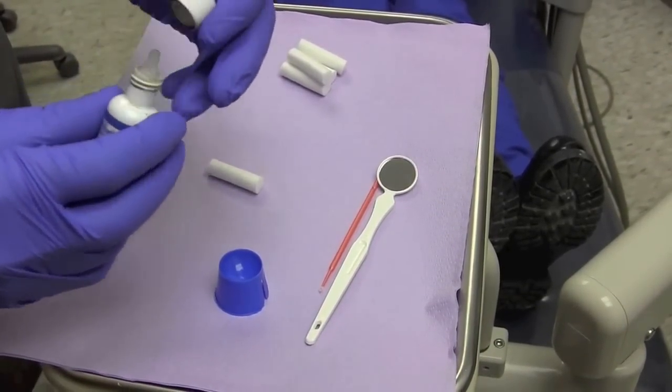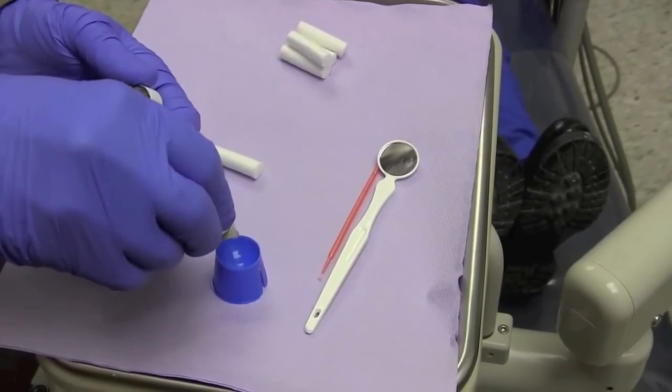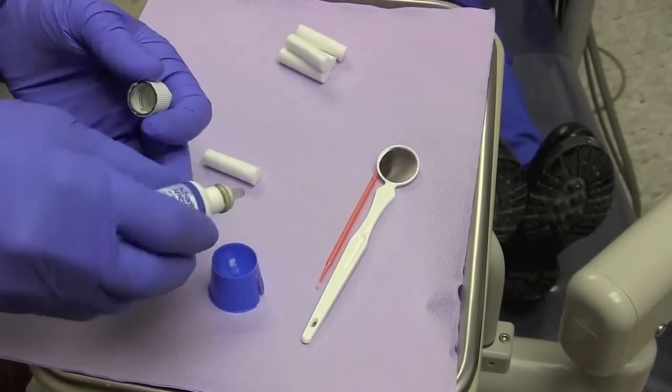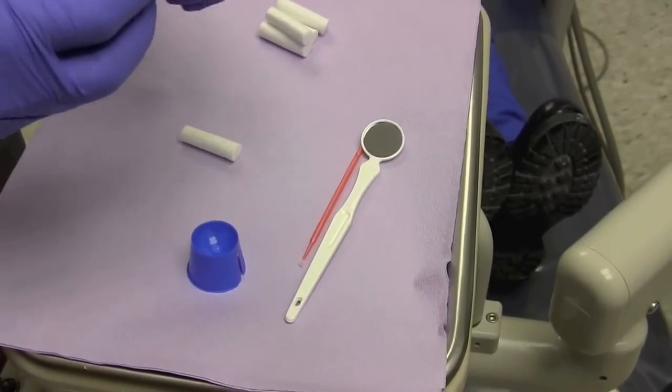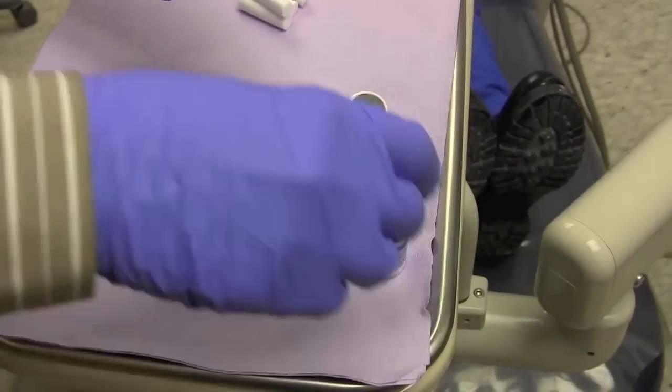You start by applying one drop into a plastic dappin dish, just like so. Anticipating that your gloves will stain everything.